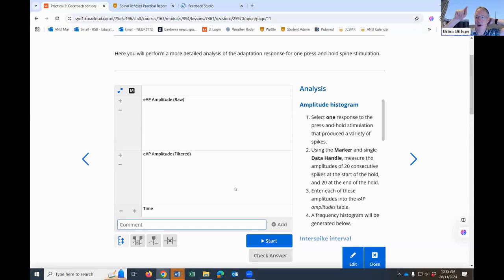So there is a sweet spot where you pretty much don't get anything. And it's just a bit of troubleshooting, basically, of you just having to go around trying to get a good connection with it. So you really need to clean it and get it on the scalp, and then sometimes it works better than other times.